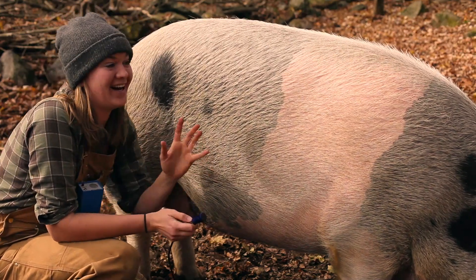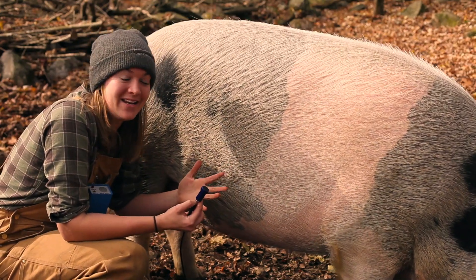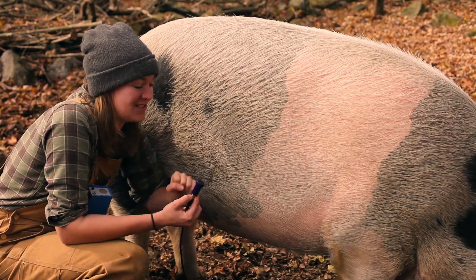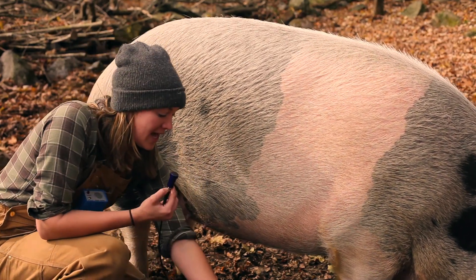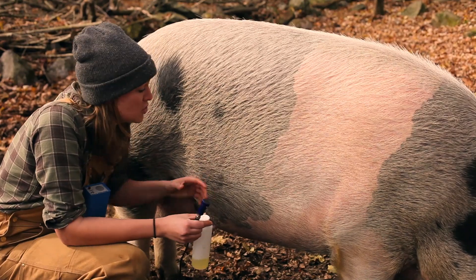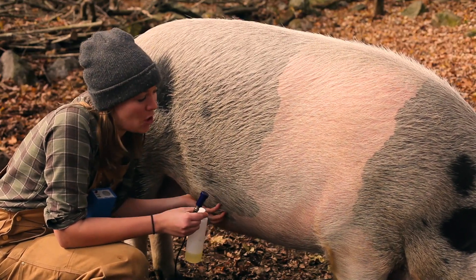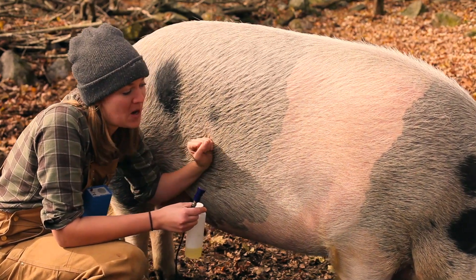So I'm calling that pregnant. I'm really excited. She was successfully bred through artificial insemination. And based on the date that I inseminated her, we are looking at piglets February 2nd. So time for me to start getting my winter farrowing plan in place and make sure that she is maintaining a proper diet so she can keep trimming down and losing weight so that she is in better shape for farrowing. And hopefully we have a big litter of healthy piglets and a good mom in Big Marie.